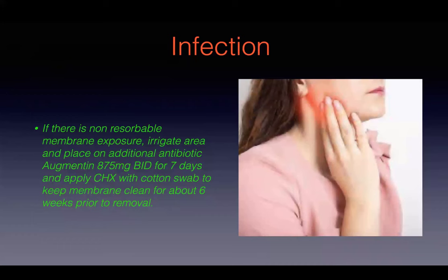Thank you, Dr. Unray. How do I feel about using a collagen plug as a membrane? I use it for small sockets, for my anteriors, for my canines, my bicuspids too. I won't use it for my molars. I think it just resorbs too quickly, and you're exposed to more complications with that. For me, it just takes an extra 2 minutes to put a cytoplast membrane in. They're non-resorbable and it heals fine.